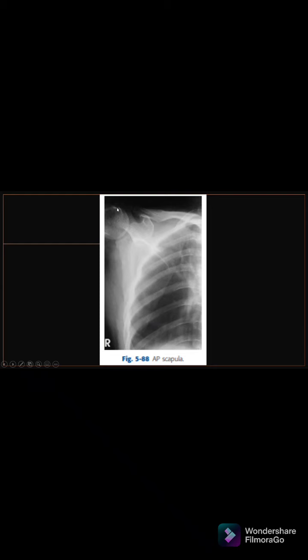This is evidenced by the lateral border of the scapula, itong dito, free of superimposition. Kasi kung hindi ma-abduct ang arm, abduct meaning moving away from the body, so superimpose ito siya. So, thanks dun sa positioning, naka-abduct ang arm, hindi na siya superimpose.